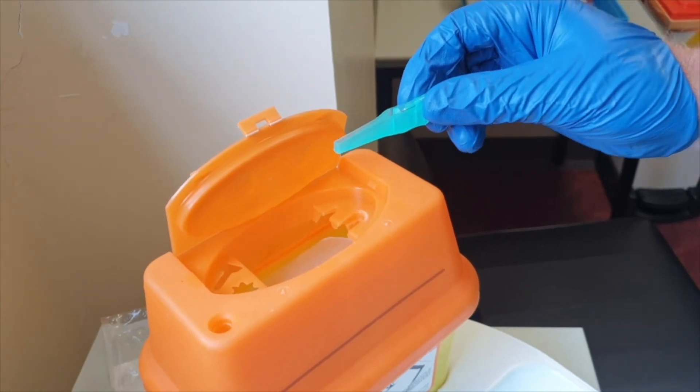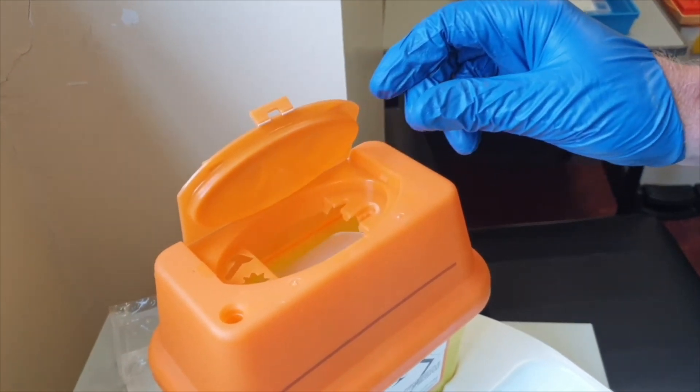Show the foreign body to the patient to reassure them that it has been removed, and dispose of all sharps.